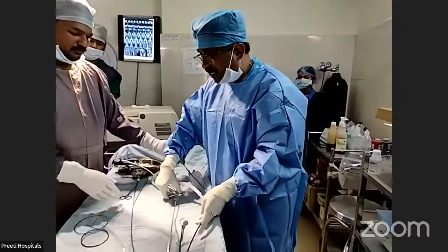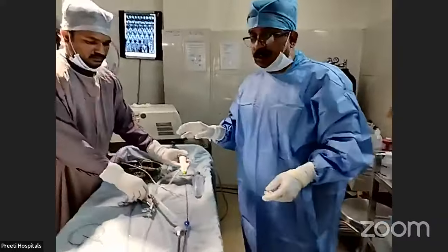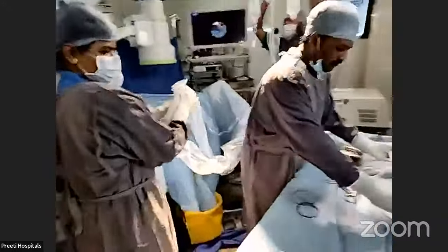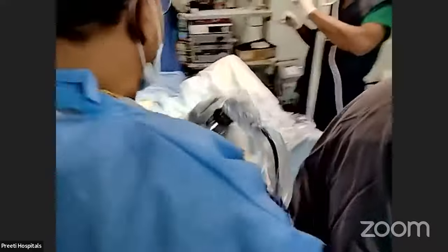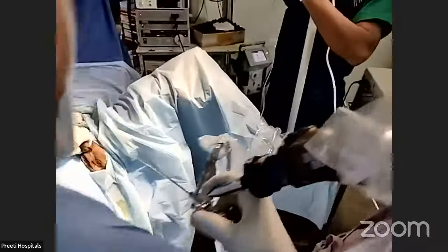The first step is a 6 by 7.5 ureteroscopy, which is there already, sister. Not to waste time, we will assess the ureter. This patient, I have already told, has a left side stone.